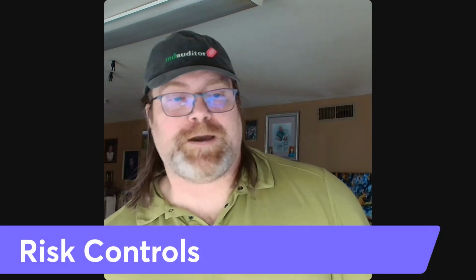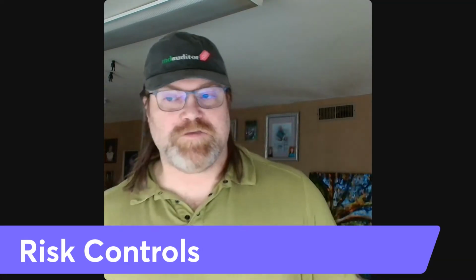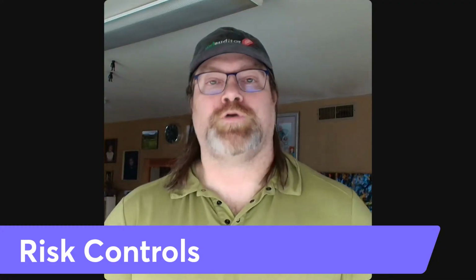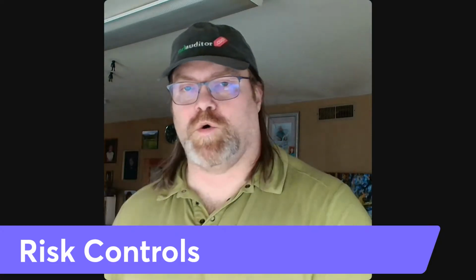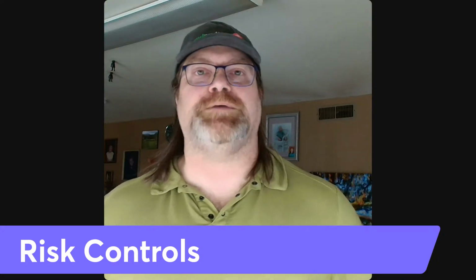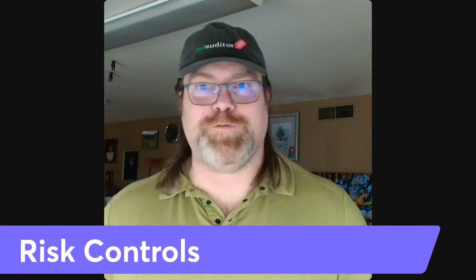Now we're going to talk about a couple of risk controls that you can use in general for either method to improve things a lot. So number one, proactive planning. A lot of the clients, whether they're using Agile or they're using Waterfall, what I hear is, I'm not ready to create a design plan or start a design history file because my design isn't done. No, that's not how it works.